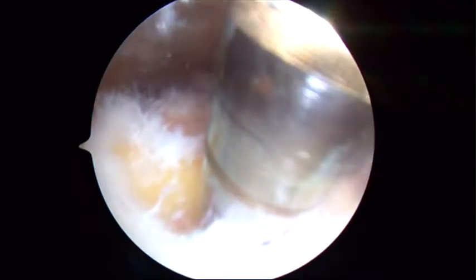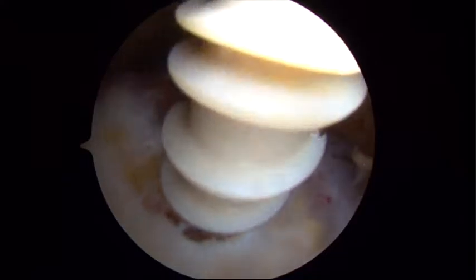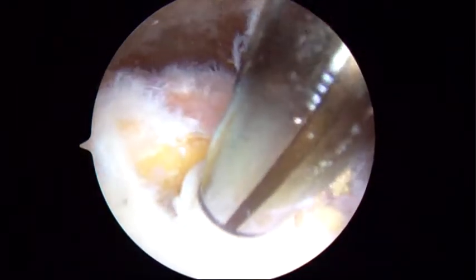In this case, the bone's pretty hard, so we went about three-quarters of the way in, and then we'll follow this with the PEEK anchor. This anchor has excellent bite on the tuberosity with its double-thread configuration.